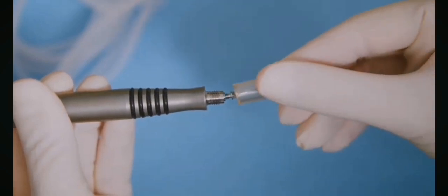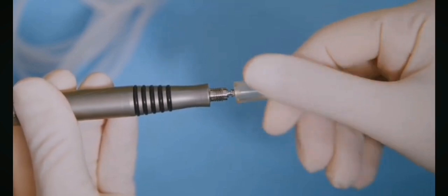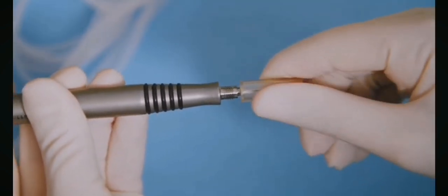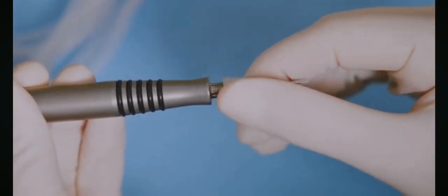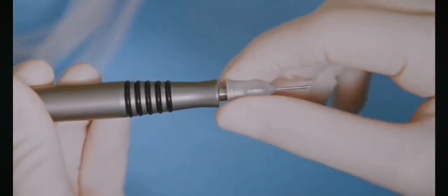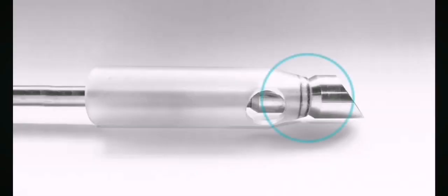Turn the tip gently in a clockwise direction until it locks into position. Remove the pre-fitted key by pulling in a straight line. Place the sleeve over the FACO tip. Get the sleeve orientation correct by adjusting the irrigation sleeve until the tip of the sleeve borders on the angle of the FACO tip.